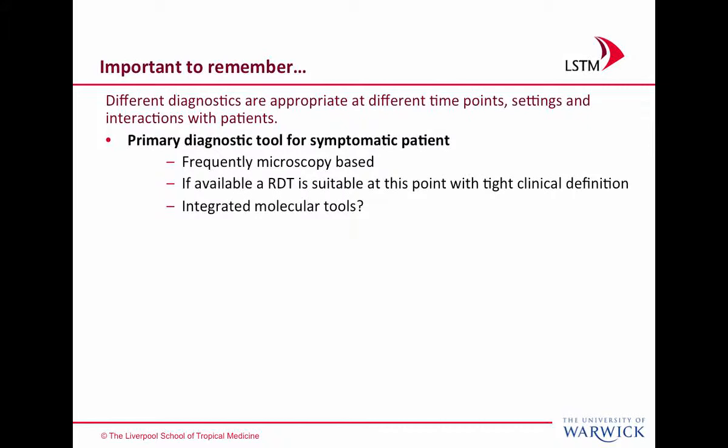And when I use the term integrated, I'm talking about tools that require little management. The training required for doing molecular diagnostics is very little, and it should be an integrated way of doing DNA extraction, amplification, and the readout and interpretation for you.